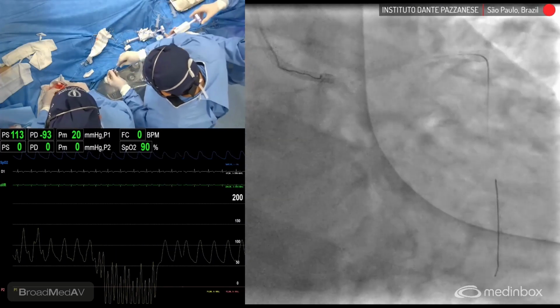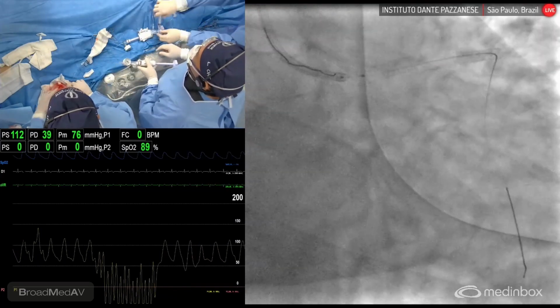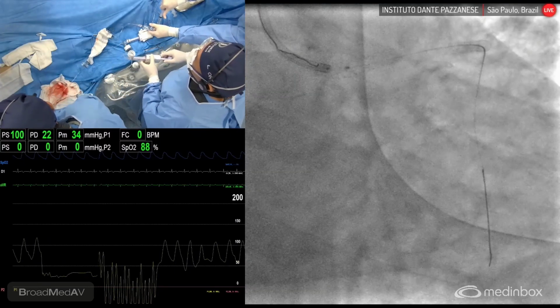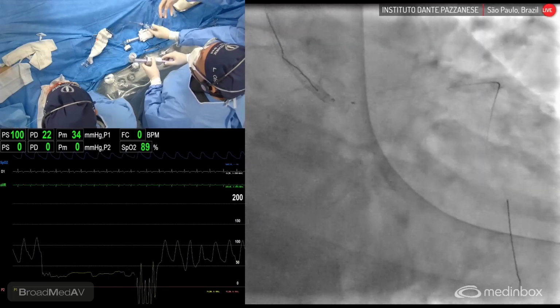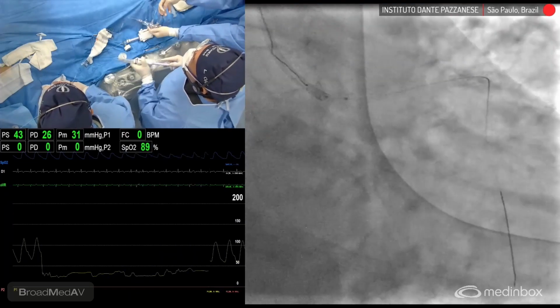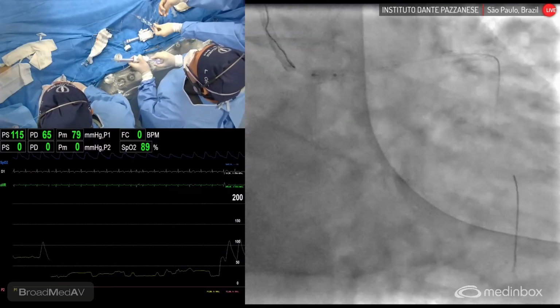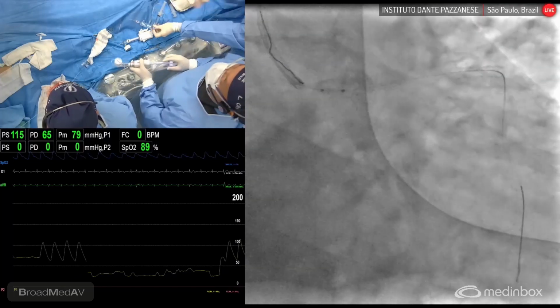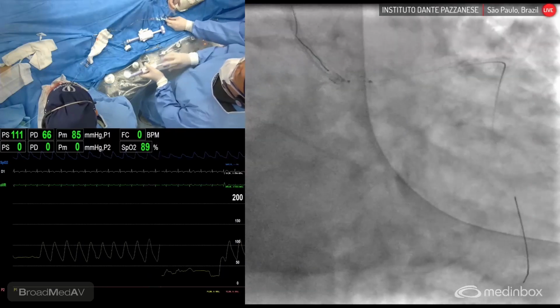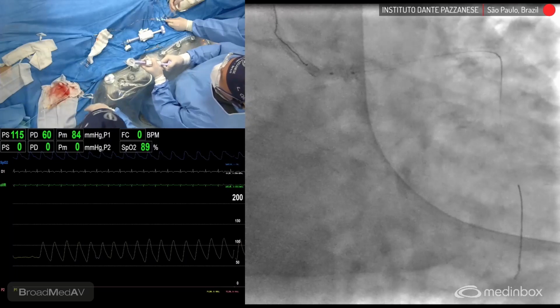The POT has the same effect as in a provisional, stepwise provisional approach. You're going to be able to fully oppose the struts into the proximal segment of the bifurcation at the carina. And that also gives you some scaffolding to the ostium of the circumflex. In this case, you're basically opening the struts at the level of the bifurcation and towards the stent in the circumflex. The patient is under sedation, so that's why sometimes there is uncontrolled breathing here.